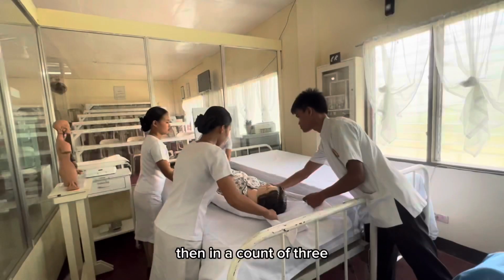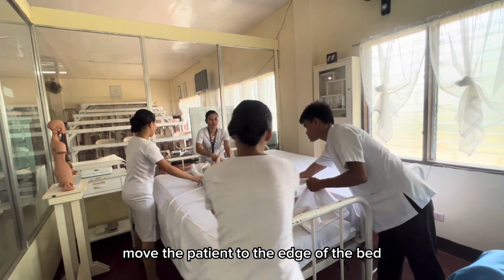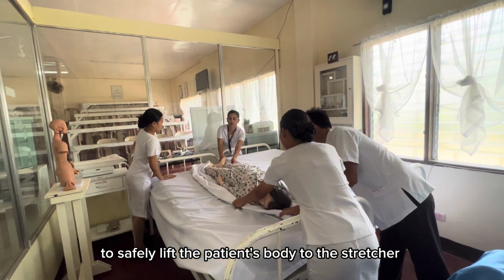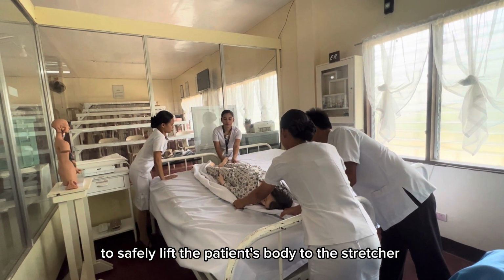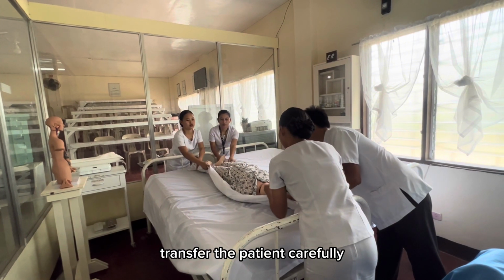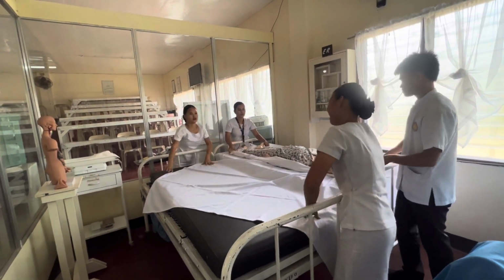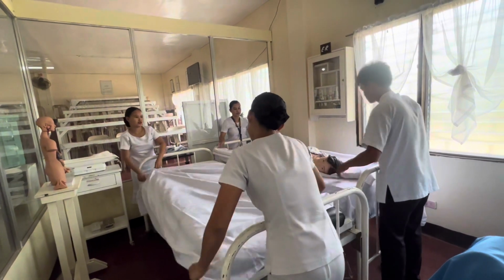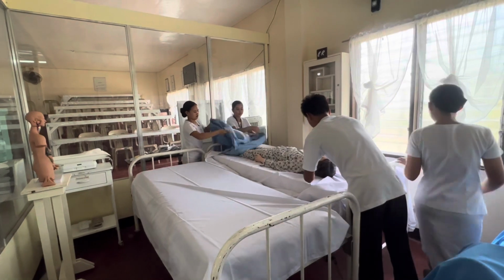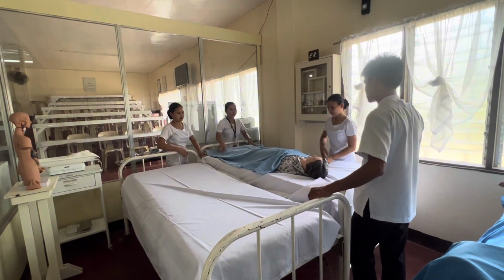Then, on a count of 3, move the patient to the edge of the bed and change your position to safely lift the patient's body to the stretcher. And then, on a count of 3, transfer the patient carefully. Then, put the blanket back on the patient's body.